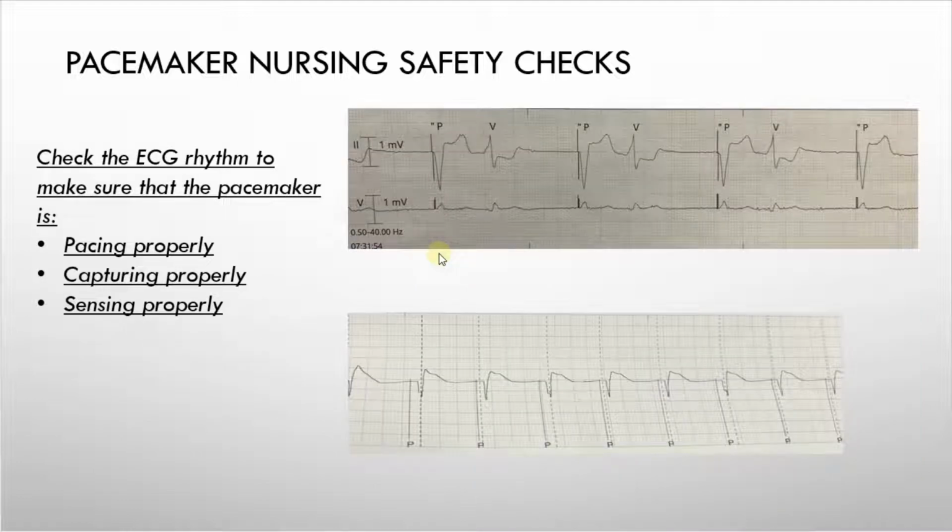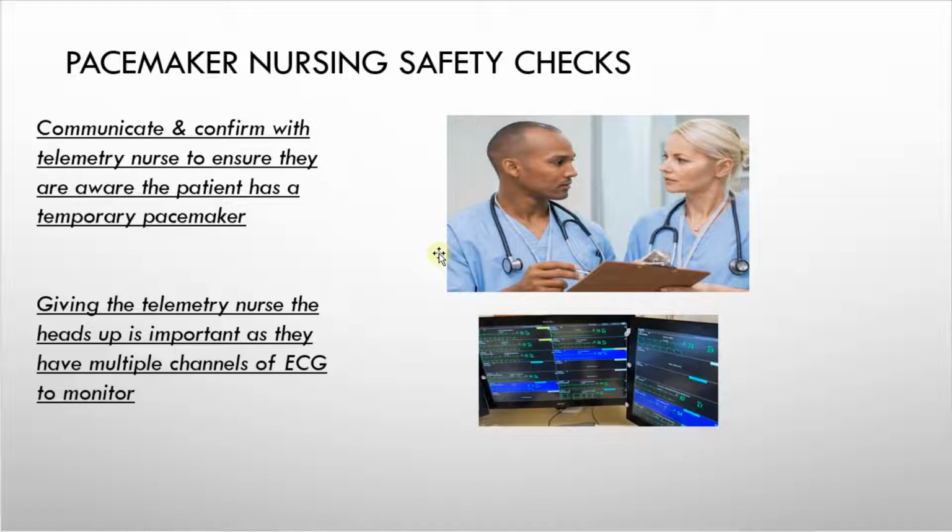Once you settle down the patient, make sure that you check the ECG to make sure that it is pacing properly, that it's capturing and is sensing properly. And this is the part where you're going to involve your telemetry nurse. Okay, communication is so crucial in here. Let your telemetry nurse know that your patient has a temporary pacemaker and wires, right?